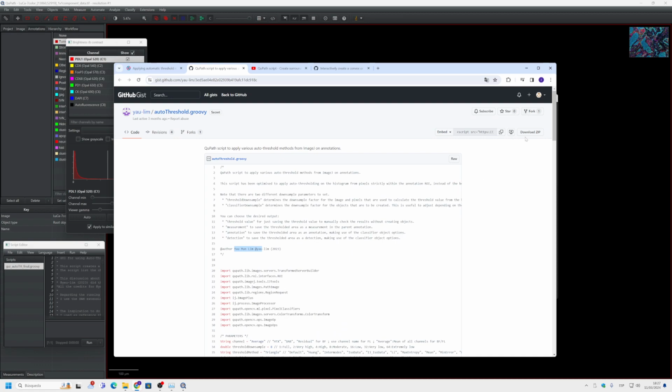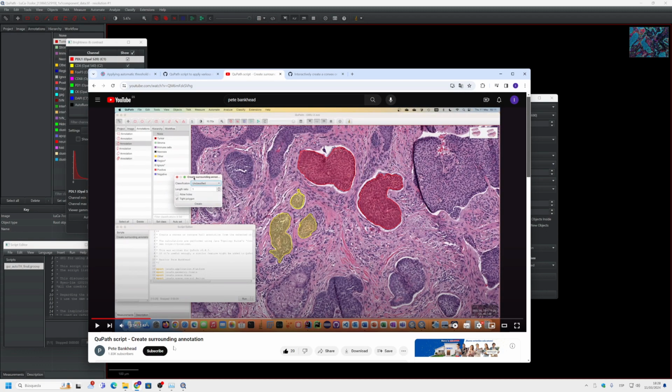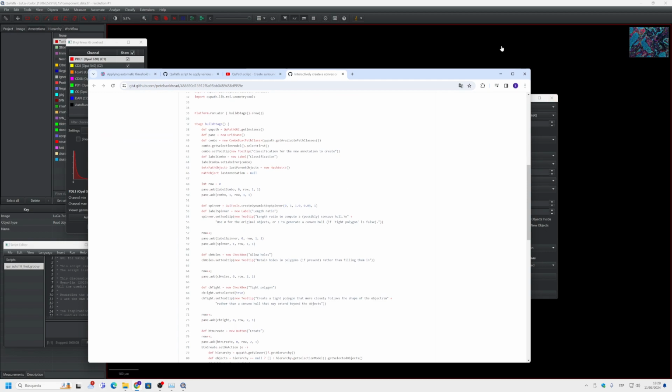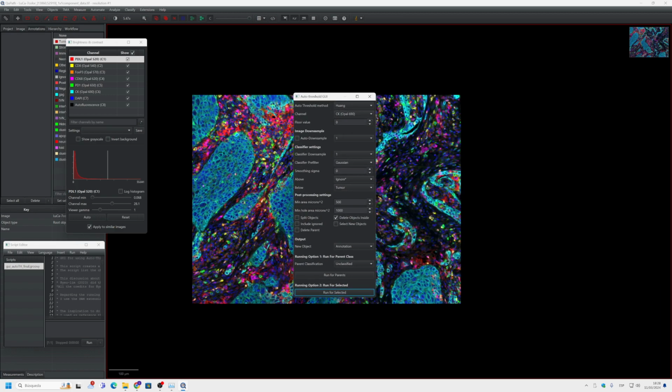I just created the graphical user interface around it because I wanted to know how to do it. I got inspiration from this video of Pete Bankhead, in which he creates a small user interface. So basically I took this script and adapted it to create what we have over here. So let's have a quick overview.